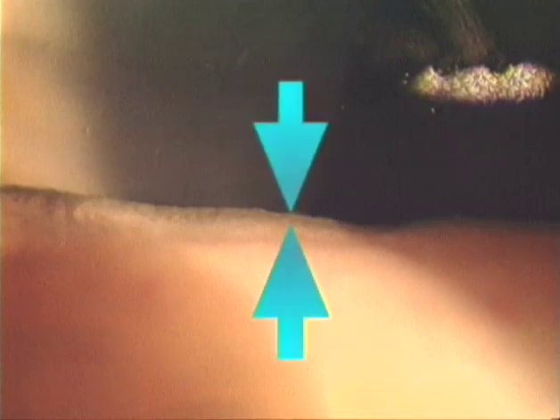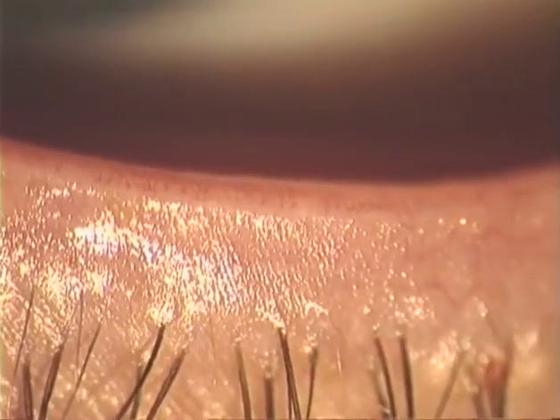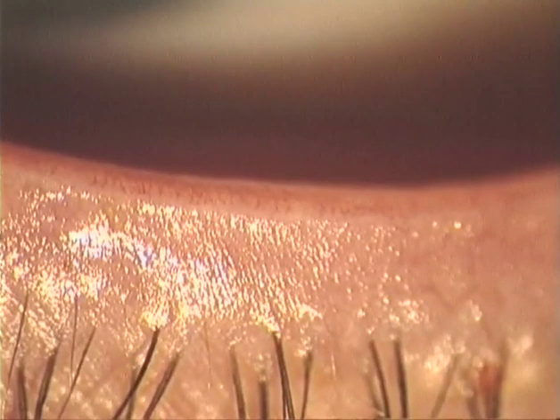Then the thickened epithelium appears as a translucent strip on top of the edge of the lid, which is bright against a dark background and is dark against a bright background. Furthermore, in this case, the tissue transformation has caused fine striations. These can be revealed by the examination of specular reflexes, which show a pattern differing from the normal rugged epithelial reflex.